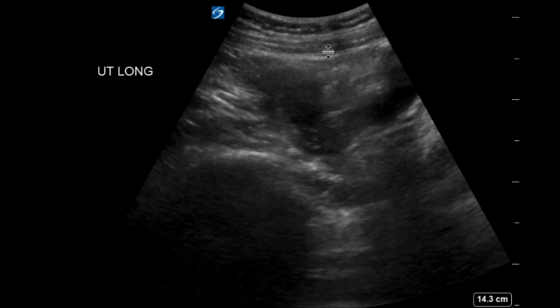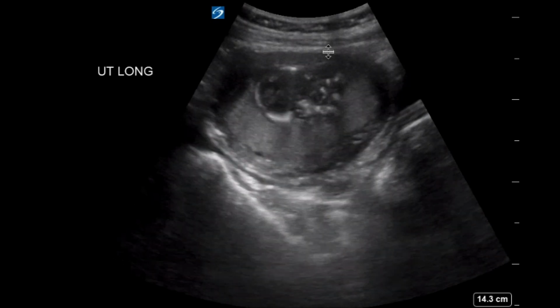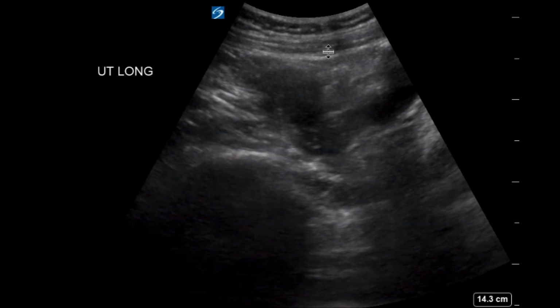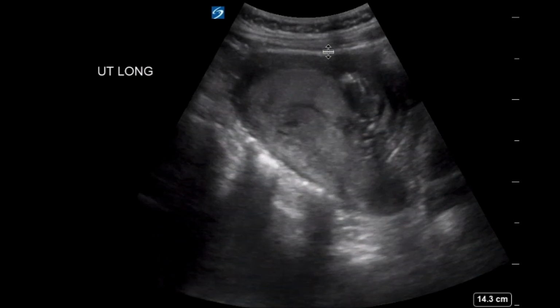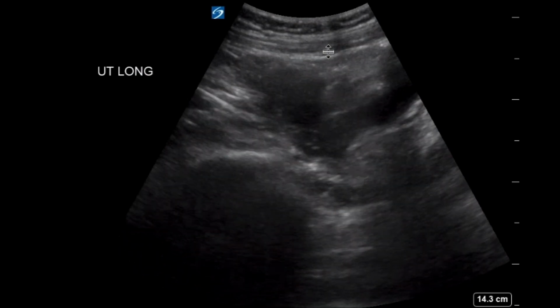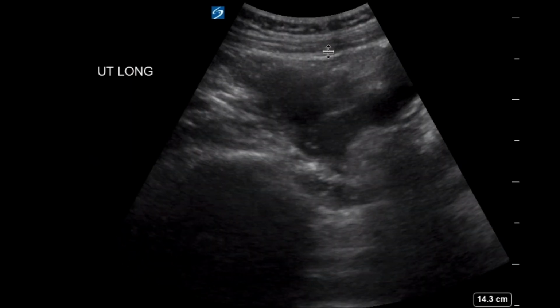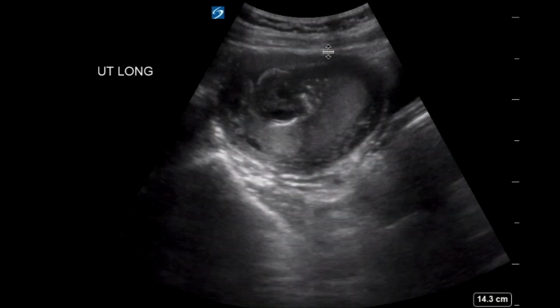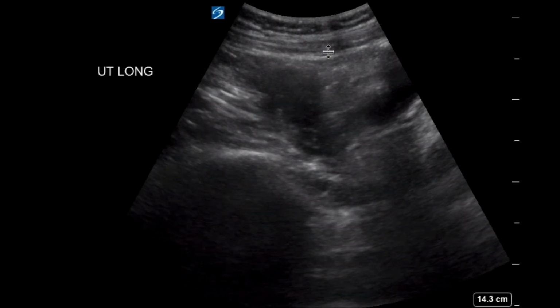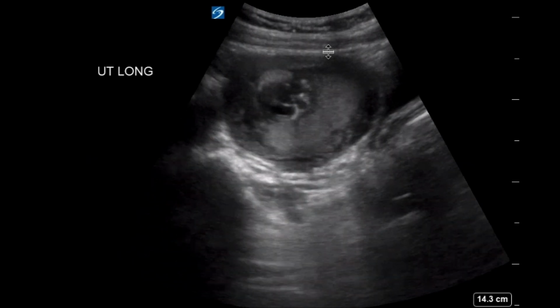When you're looking through for the fluid, there's really not much to measure here, but have you heard of any other ways that you can measure fluid? There's a pocket depth gauge that you can do for fluid status within the amniotic sac, the MVP? Maximum vertical pocket. But can you use that in first trimester?